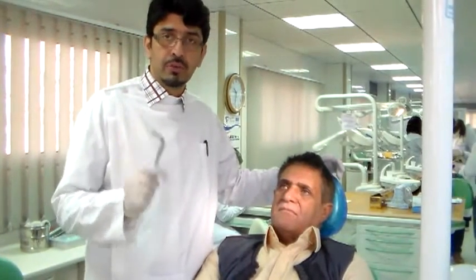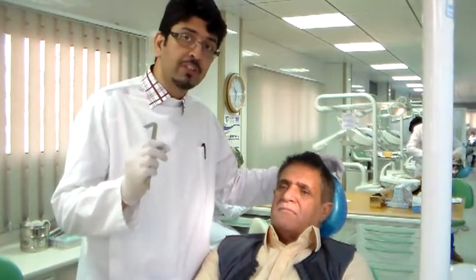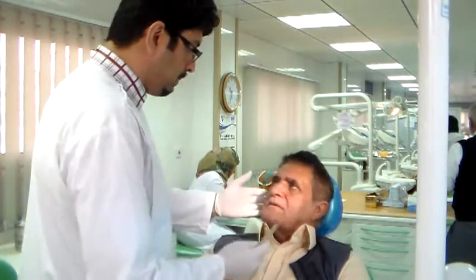It's a good idea to write down the vertical dimension at rest. You want to measure the vertical dimension at rest a couple of times so that you can take the average of it, and that will be the vertical dimension at rest that you choose. Now I've written down on the piece of paper 67. Want to try this again?